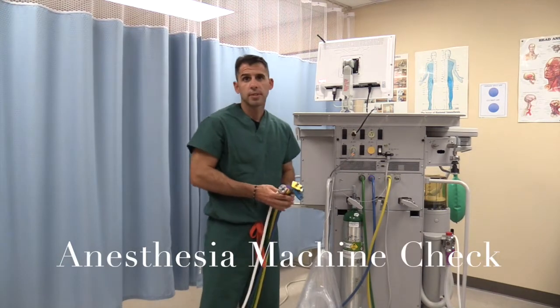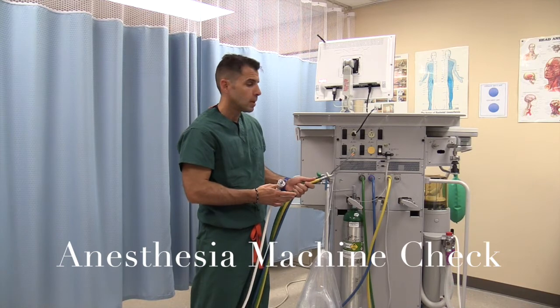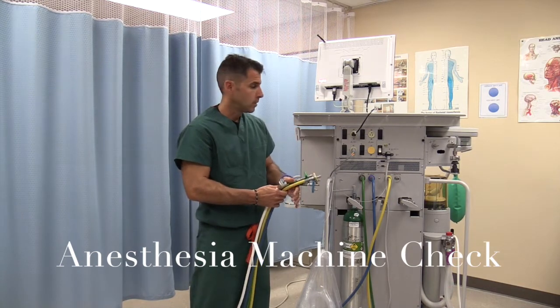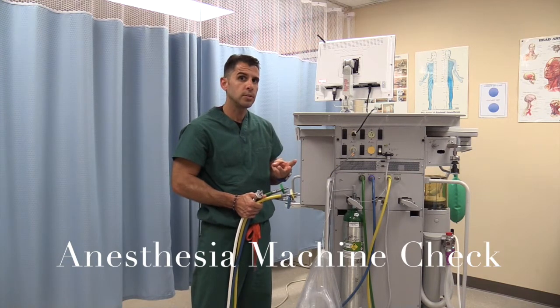Hello. The purpose of this video is to go over the anesthesia machine. When you go into an OR room, the first thing that you will do is check your anesthesia machine. There are three different things that you have to look at.